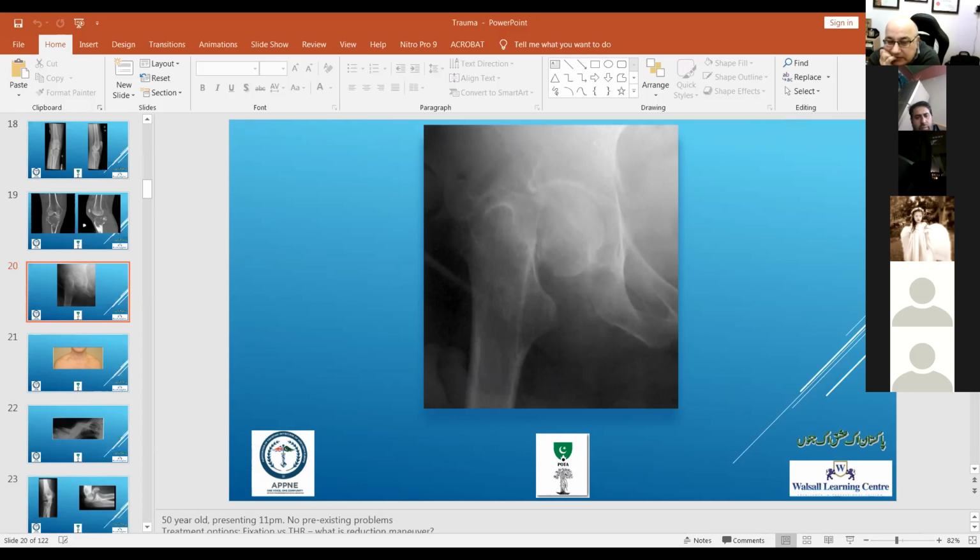Where are you measuring these from? From the horizontal. So where are you drawing your lines? Sir, we are measuring from the fracture line to the horizontal. Very good. Okay. So why is that important? To see the shearing forces transferring from the head to the neck of the femur.